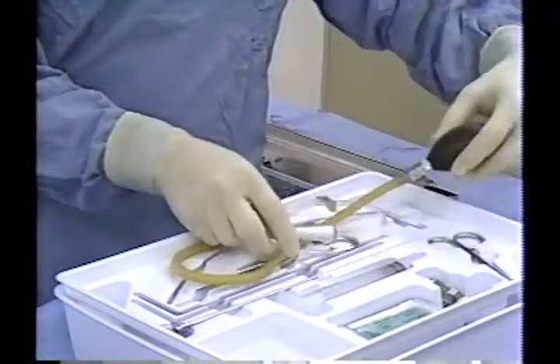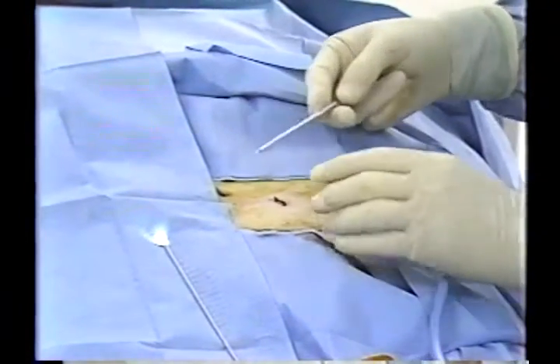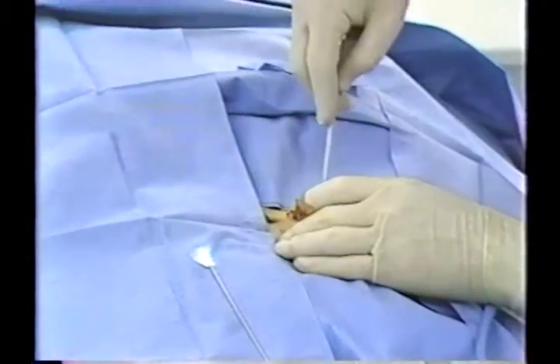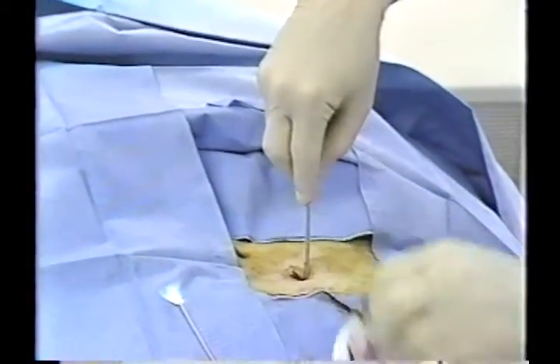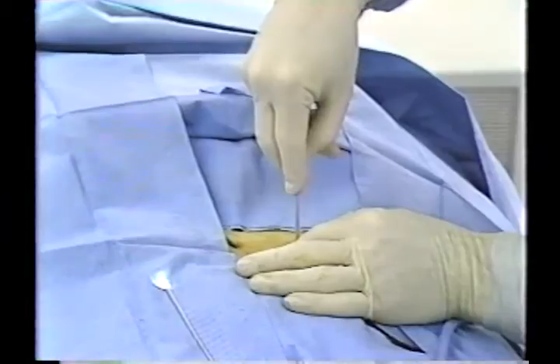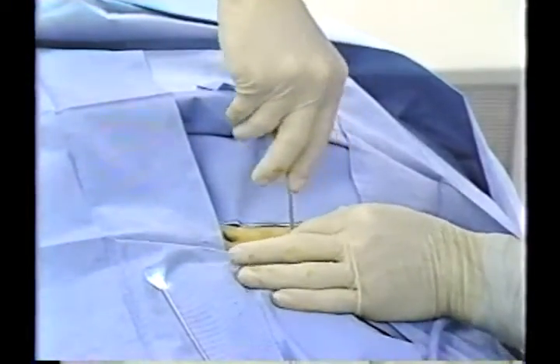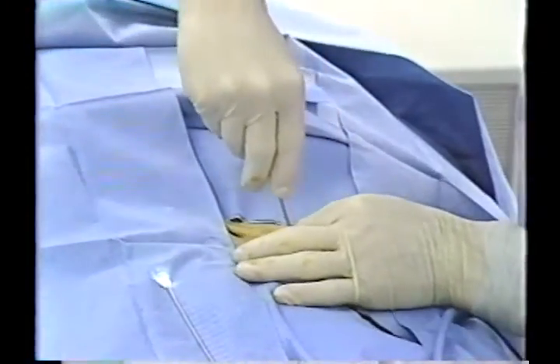The quill catheter guide assembly is removed from the tray and checked that the trocar is firmly seated in the cannula. The patient is asked to tense his abdominal musculature, and the quill catheter guide assembly is then advanced blindly into the peritoneum at the desired catheter location. This is accomplished using a slight twisting or rotating motion, as with an acute peritoneal dialysis catheter. Entry should be shallow.